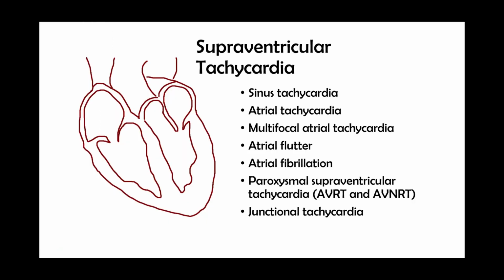This is a good chance for us to transition to supraventricular tachycardia, or SVT. This is a term you'll hear thrown around a lot, and it's important to know what this means. The name pretty much has the definition within it. It is a tachycardia resulting from somewhere above the ventricles. This can either be from the AV node or the atria.